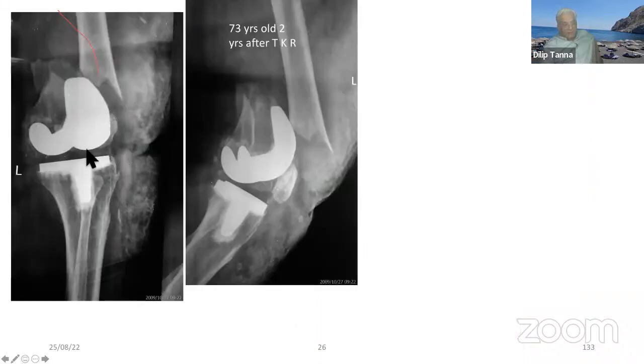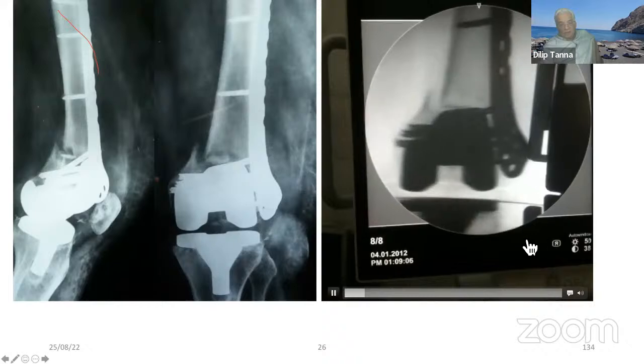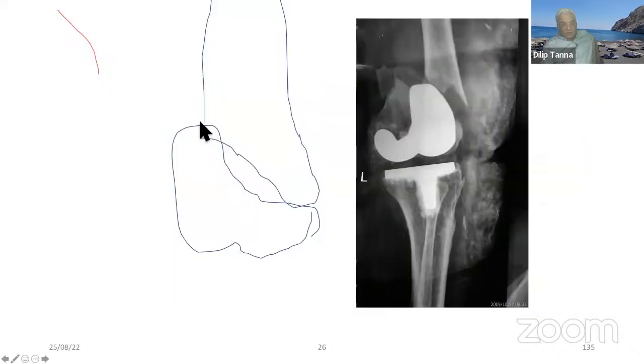But a fracture like this, now this fracture is below the flare of the femur prosthesis. Now, when you do this fracture, then a single plating is no good. You can see they have done the single plating and this has gone into non-union. Here is another case, single plating, this has gone into non-union. This is not desirable because this fracture is an oblique fracture like this. So when you do a single plating on the lateral side, the hold on the distal fragment is hardly any.